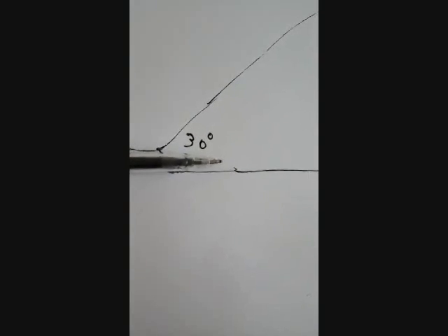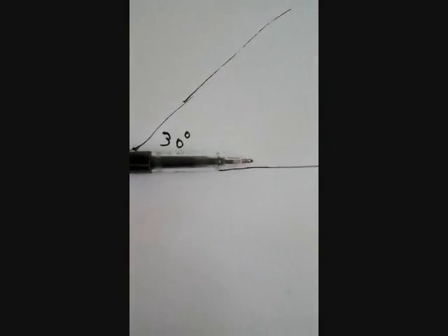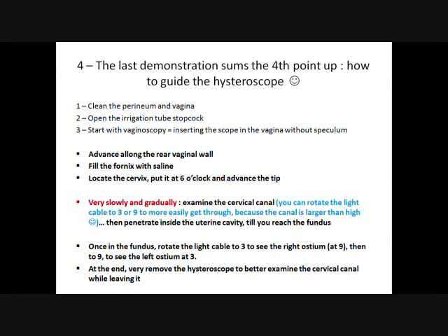And one of the most frequent attitudes of a beginner is moving like that, those quick and nervous movements up and down, backward and forward. It's very bad. The point is to move very, very slowly and gradually, like millimeter per millimeter. It's very important.